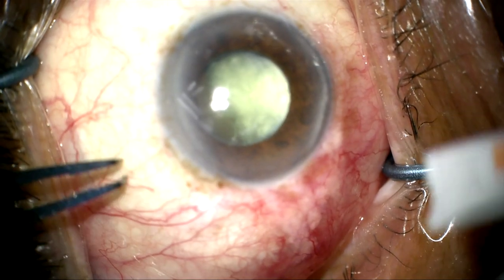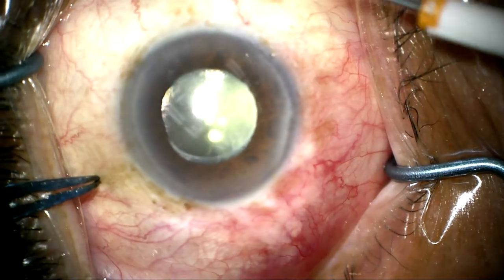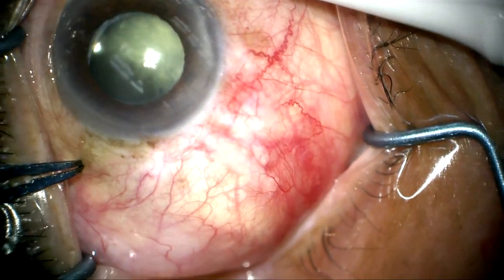This is a patient referred 2 years after cataract surgery with a significant amount of lens debris in the capsular bag interfering with his vision. We're going to remove this with a pars plana approach to go behind the lens and through the capsular bag.